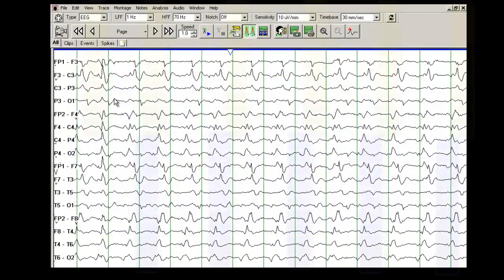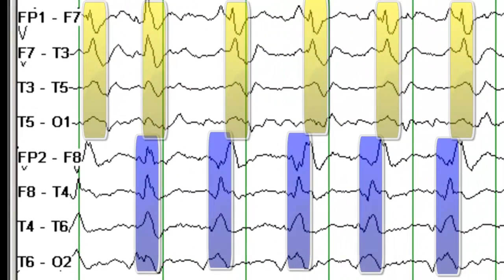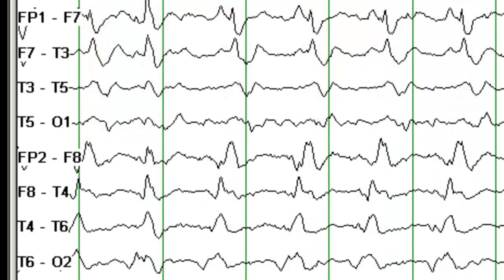BIPLEDs imply that these are lateralized epileptiform discharges which are asynchronous, which are independent in the two hemispheres.